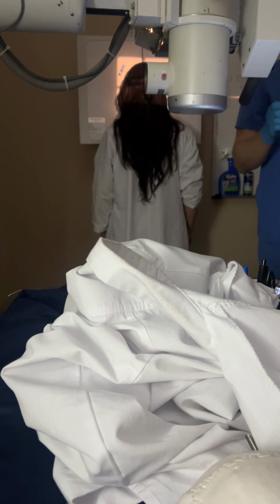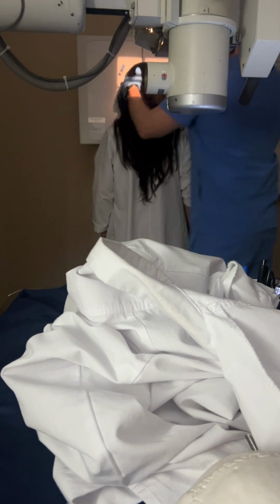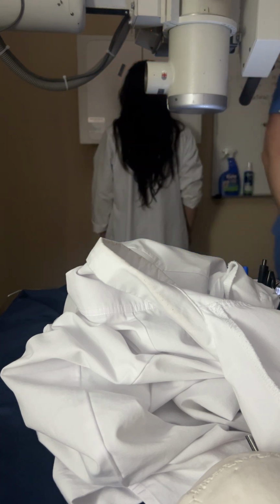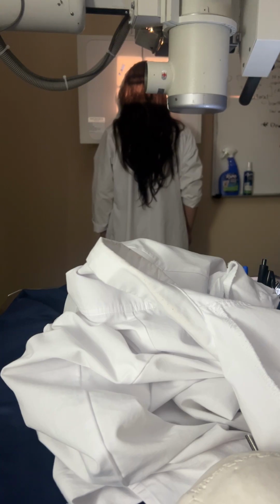Okay, wait. What? Okay, you just did 15 degrees. Sinuses like that. Make sense? Zero tube angulation for Caldwell for the sinuses. Because you're checking for air fluid levels. Which one before that was for the skull? Yes.